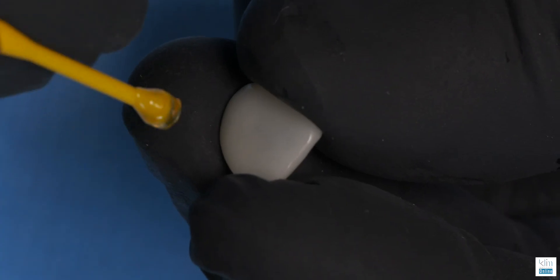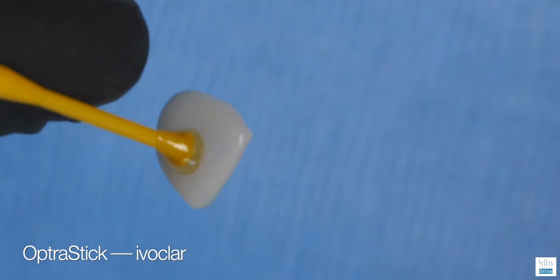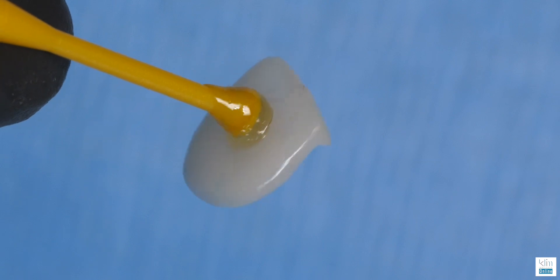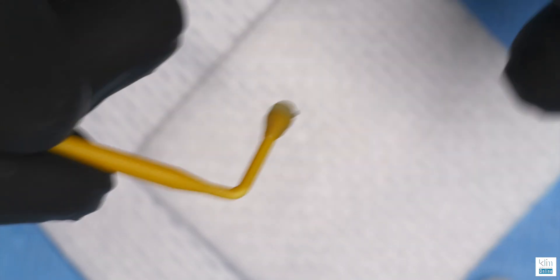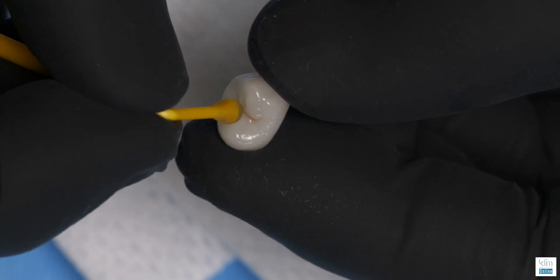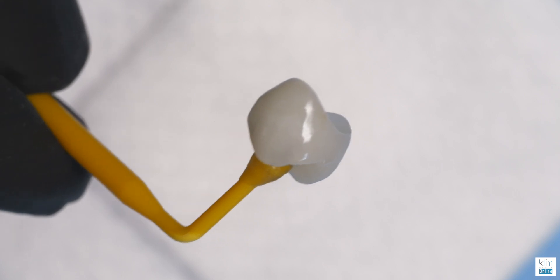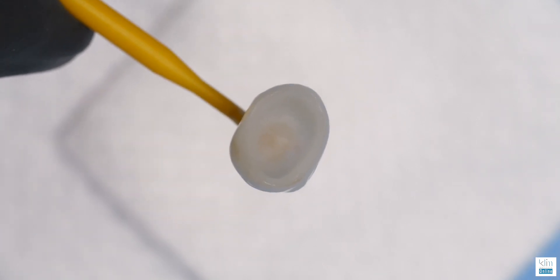An excellent way to hold the ceramics while conditioning them is the Optra Stick by Ivoclair. You can see that even with some movement, it will not break loose during the process. You can bend them at right angles and place them on the occlusal surface for posterior teeth, which makes placement a lot easier. Most importantly, they don't break loose while you're conditioning the ceramic or applying it in the mouth.